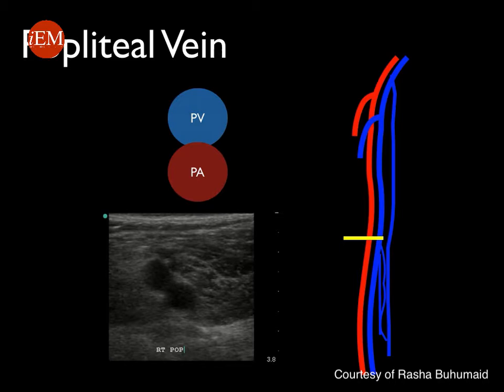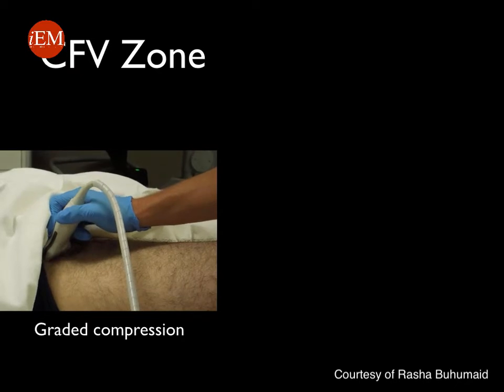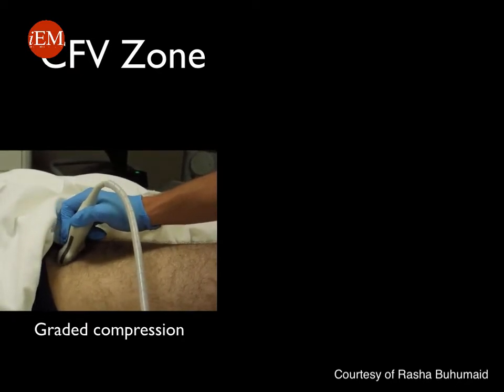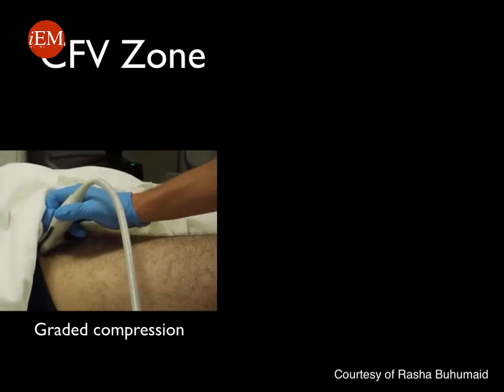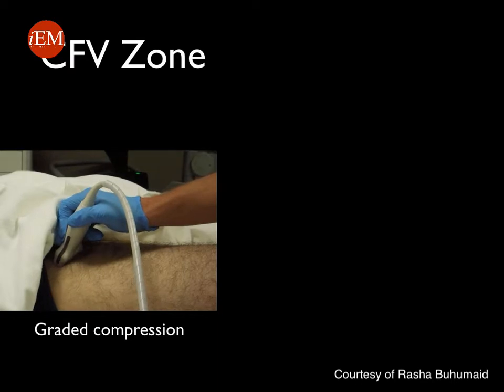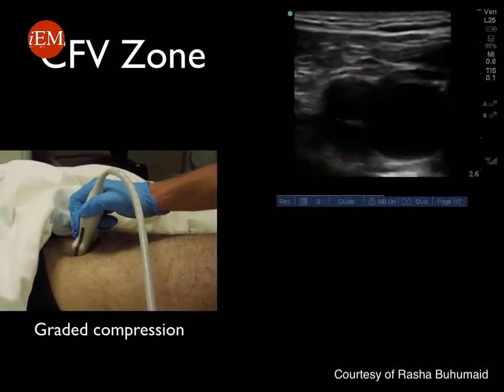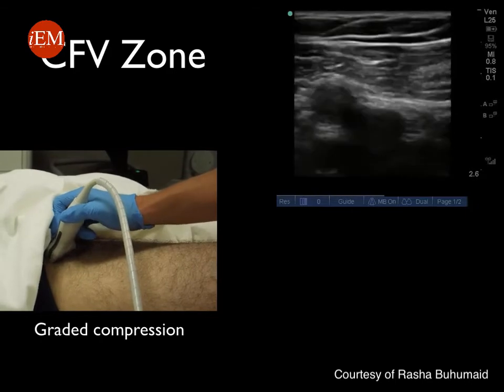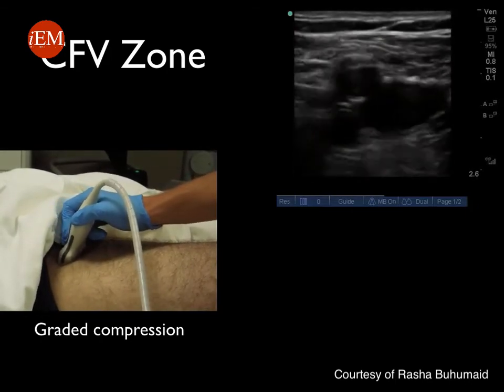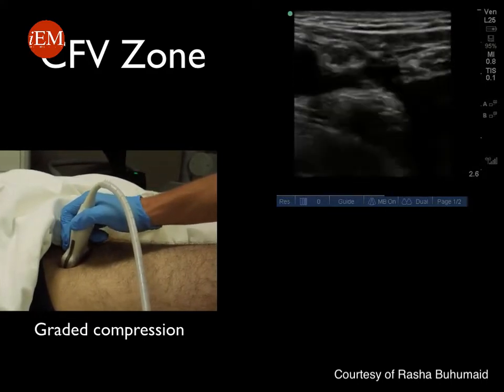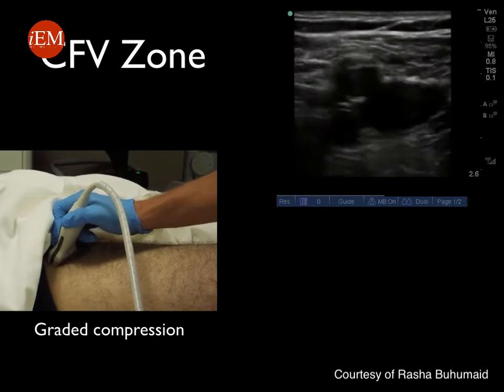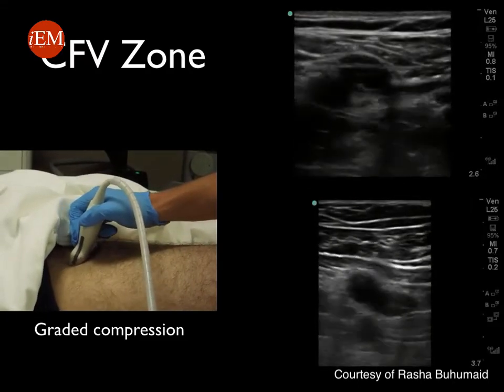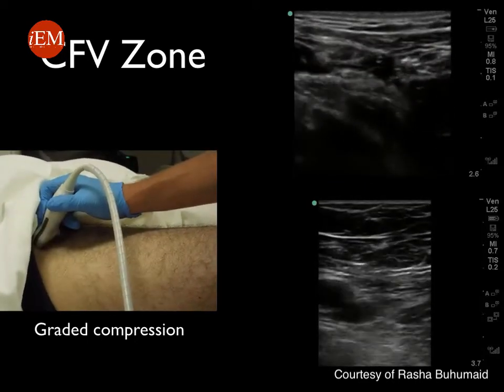All of these veins are evaluated using graded compression. Place the probe at the inguinal ligament with the probe marker towards the patient's right, then evaluate the anatomy and compress the vein with pressure. You want to demonstrate that the walls of the veins are compressible, touching each other — this rules out DVT at that specific location. In this clip you will see that the common femoral vein is nicely compressible, and moving further distally, where it becomes the superficial and deep femoral veins, all segments remain compressible.